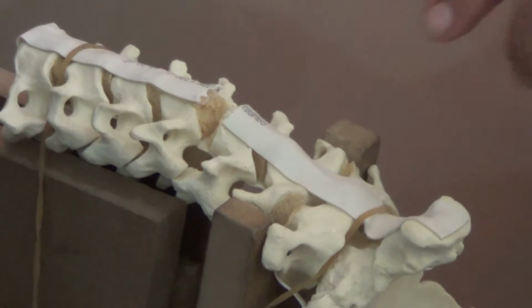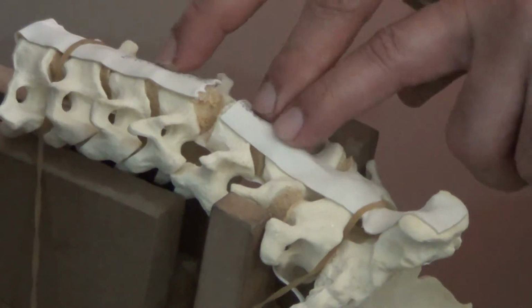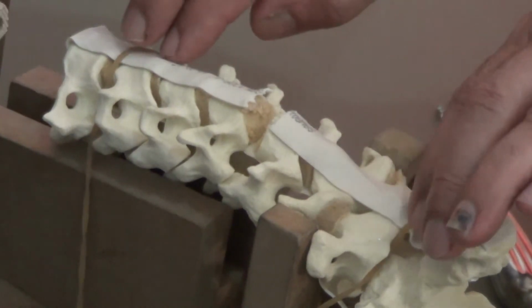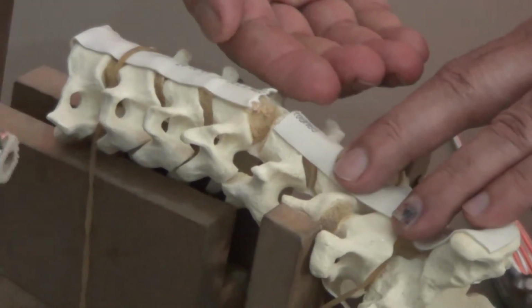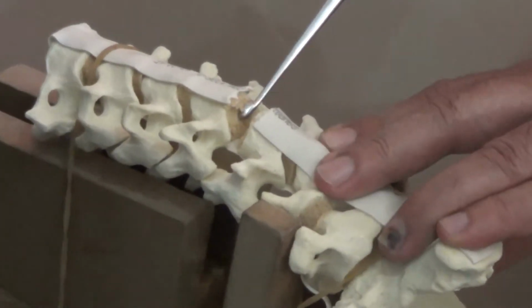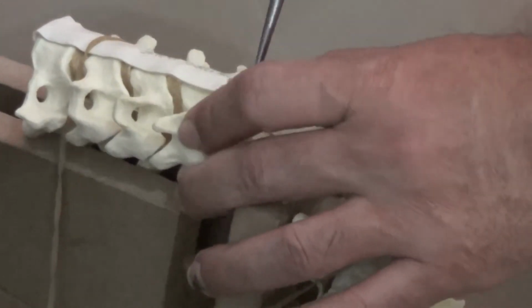And before that, what I do, I use the Caspar retractor. You put the Caspar screw here and there, then you are distracting. When you are distracting, you are putting stress, and then you can understand the posterior longitudinal ligament. You can feel it, you can see it. When you give the distraction, the posterior longitudinal ligament is well visualized. Okay, then you will make a stab incision.